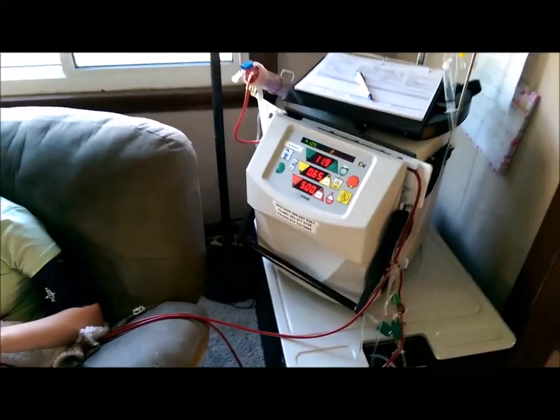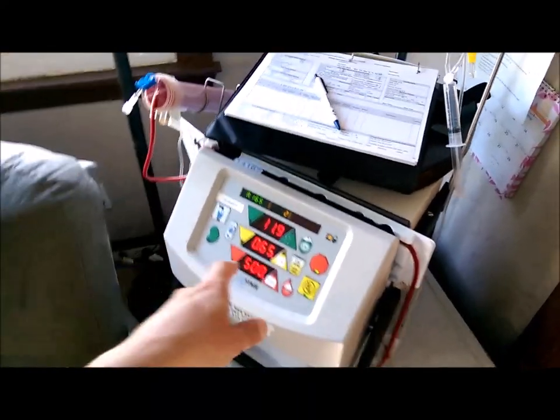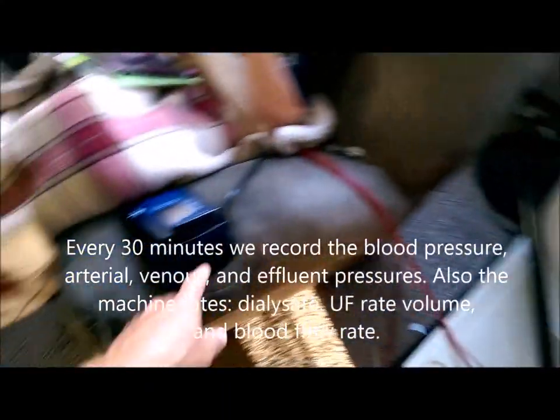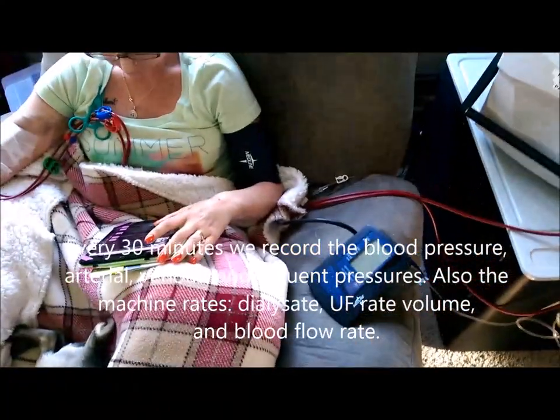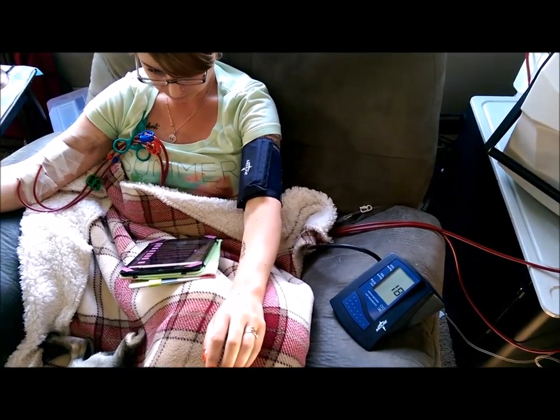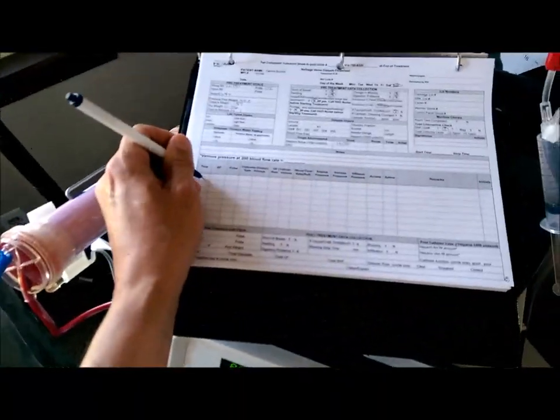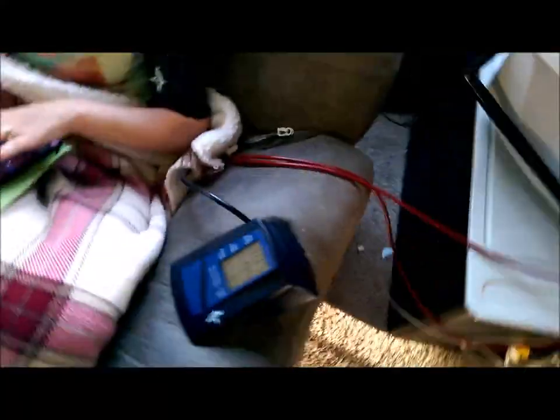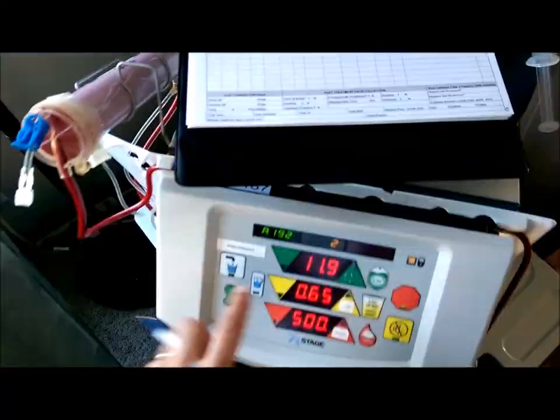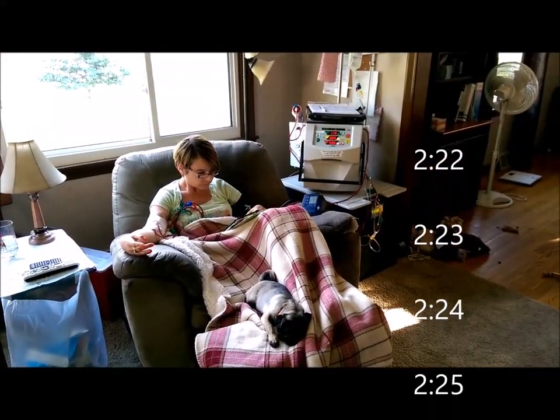Tammy's been on the machine for 15 minutes now. After the first 15 minutes and about 30 minutes after that, the machine goes into a check of all the systems — that's the opportunity we take to take her blood pressure. We have to take her blood pressure several times during treatment just to make sure that everything looks good. If her pressure gets too high or too low, she'll start feeling real sick and it's a sign that something's wrong.